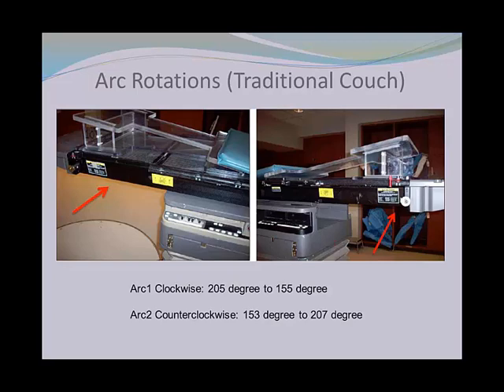Okay, we have this VMAT chest wall case, and with this patient, when we simulated her, we had no intention of treating the patient with VMAT. Also during simulation, we couldn't do breath hold on her. She couldn't tolerate it. So we ended up with this scan, and as you can see, the heart is very close to the chest wall.